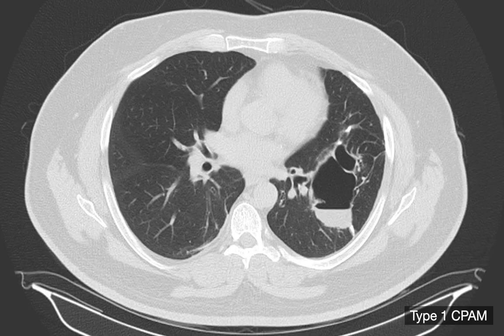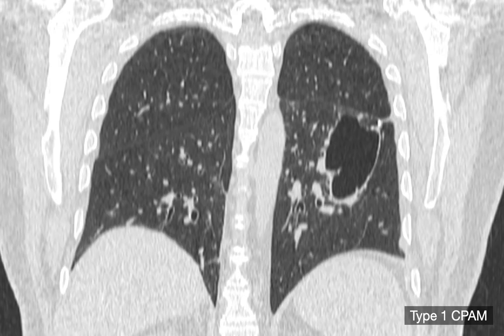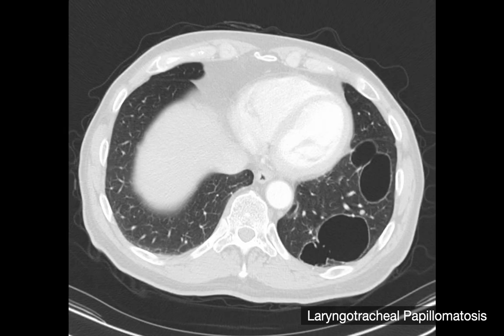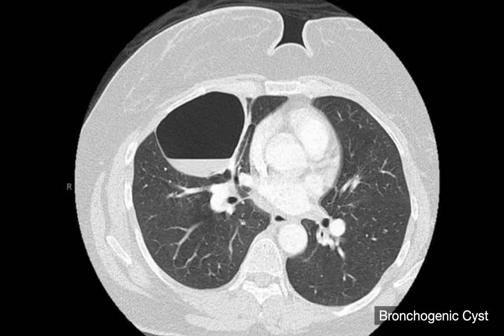Other types of CPAMs, like type 1 CPAMs, are not specific because there are other things that look just like these. Here's an example of a type 1 CPAM where the cyst size is much larger. They tend to present with at least one large cystic area. The problem is there are many other diagnoses that can look just like these — examples include laryngotracheal papillomatosis and bronchogenic cysts. So type 1 CPAMs are not considered a specifically presenting mass; type 2s can be.